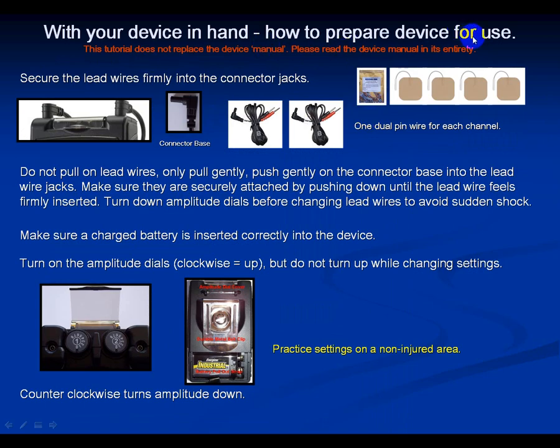With your device in hand, let's prepare the device for use. Undo two lead wires, insert the connector base into channels one and two, open a supplies package of electrodes, and get four electrodes out. Don't pull on the lead wires — push gently on the connector base into the lead wire jacks until firmly inserted. Turn down the amplitude dials before changing or adjusting lead wires, as a disconnected lead wire or electrode could cause an unexpected shock.